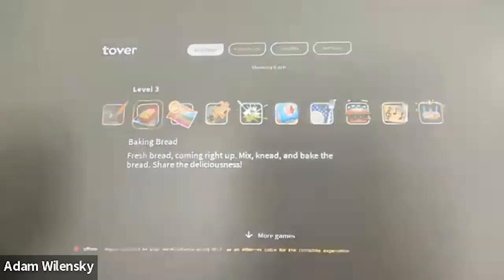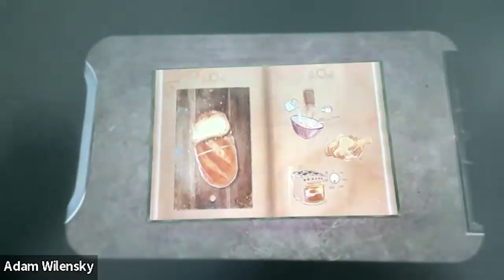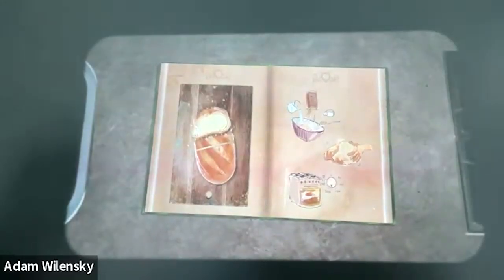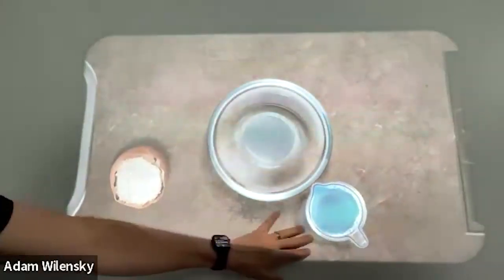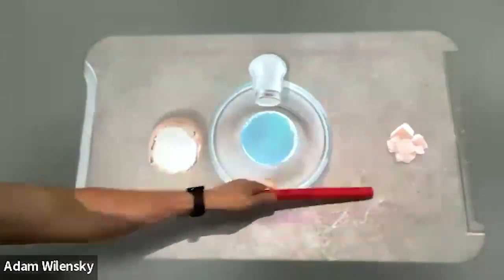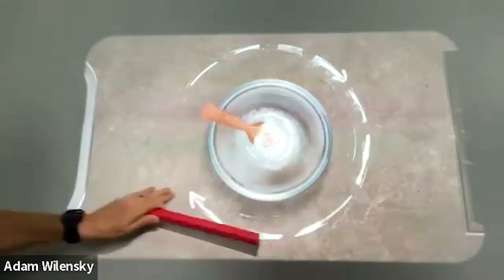The question before had been, how do I engage my residents? Well, one very practical way to do that, which also can incorporate people who are tasked with physical therapy, occupational therapy, maybe a variety of cognitive care functions. In this instance, props are absolutely invaluable. And props are going to do a couple of different things. One, they're going to create a direct physical connection, and they're going to help your residents, those that might have limited mobility, navigate the game and allow them to participate, right? Failure free, as Tipa says.